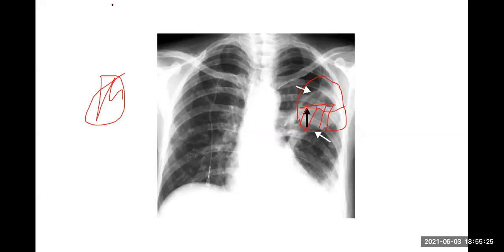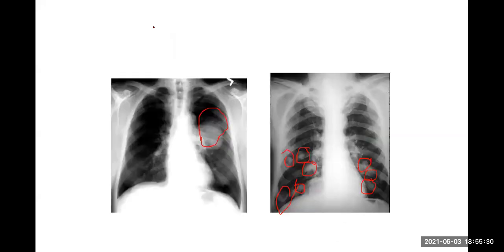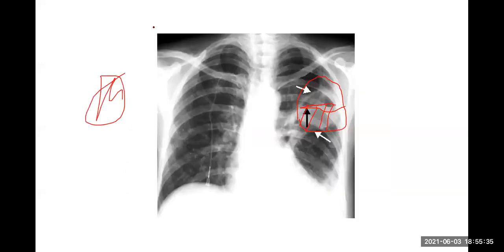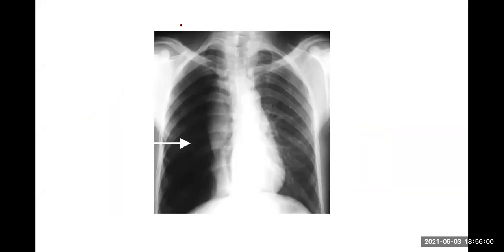So now many small nodules, miliary, whatever, right? Then single nodule, multiple nodules, and a cavity with a fluid level. All very similar looking things that you need to differentiate. This is a lung abscess. And if you look carefully, you can see this line also. Why? Because the patient is getting a long course of antibiotics, central line antibiotic. Because for a lung abscess, you need to treat it for long, sometimes 4 weeks, 6 weeks of antibiotics. Right, this is not very important.